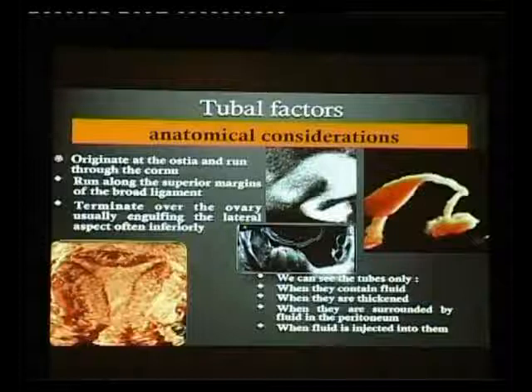And then, even on a Day-2 scan, suppose we pick up incidental findings of a dilated tube, and it turns out to be maybe pyosalpinx, we can calculate the exact amount of fluid inside that dilated tube using some of these 3D technologies.